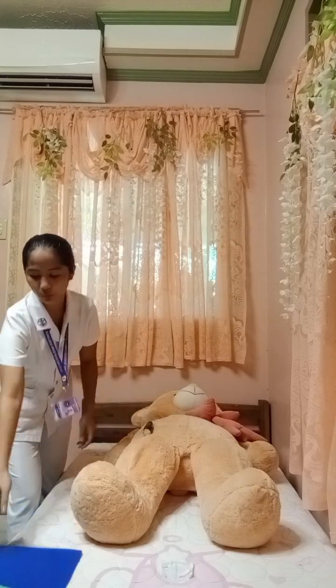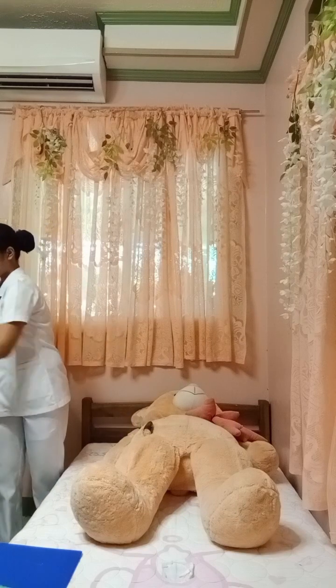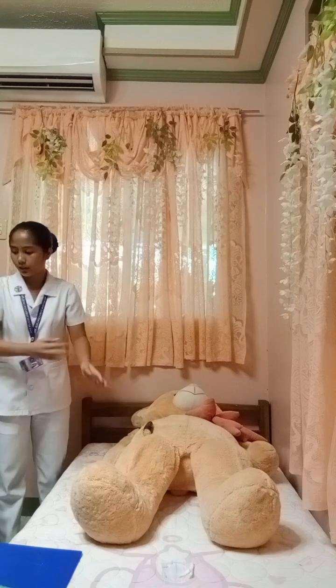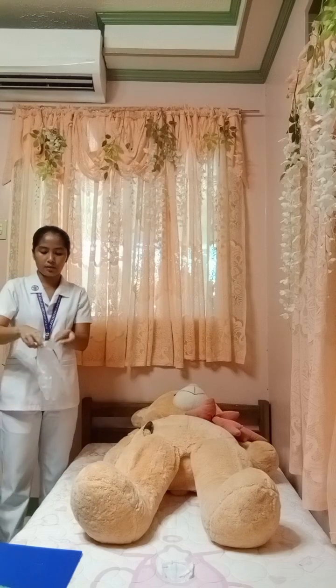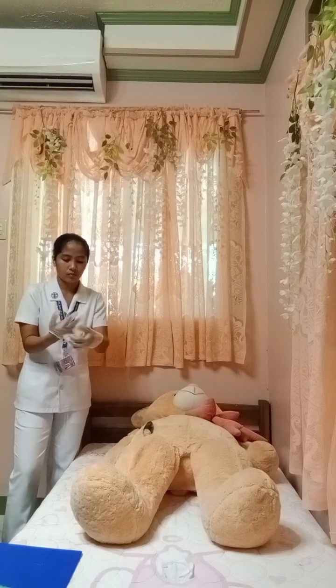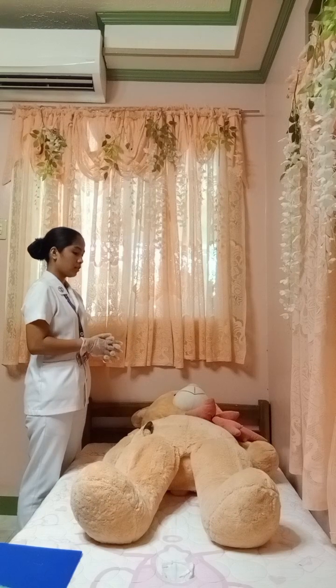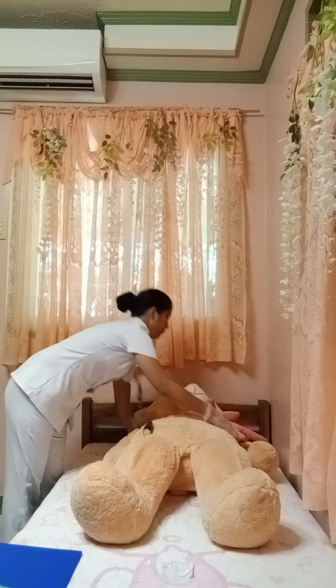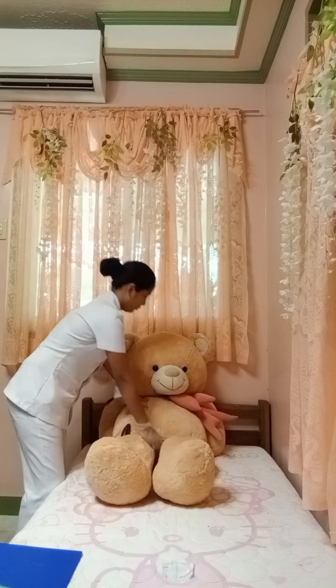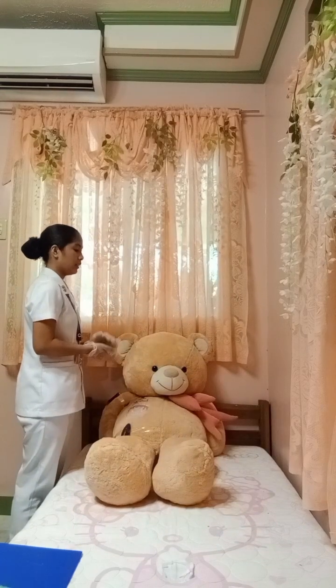None. Okay, so now I'll be performing hand hygiene and wear my gloves. This is to prevent cross-contamination. Alright, so now ma'am, let's proceed to the intramuscular injection. First I will be assisting you to a sitting position. Then select the target site, which is the deltoid site.